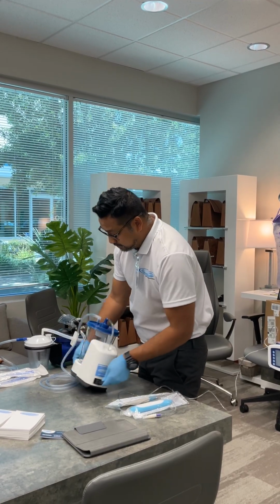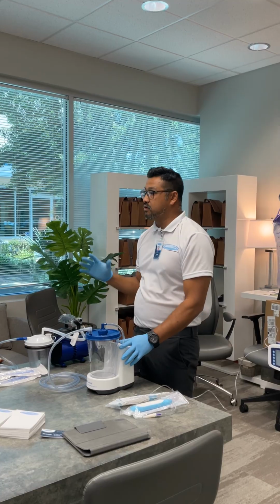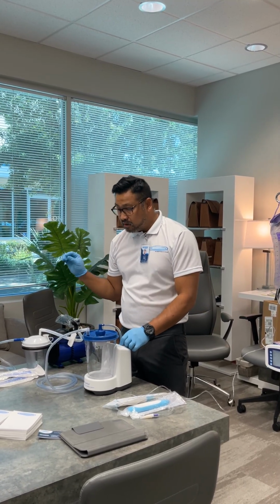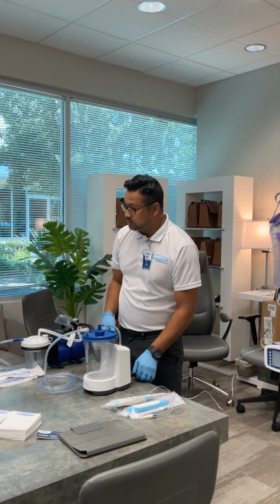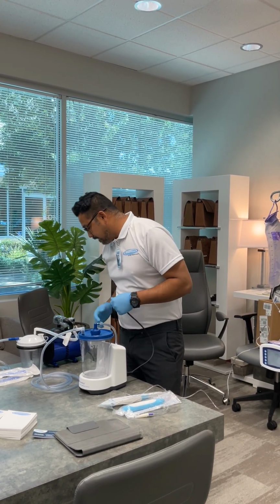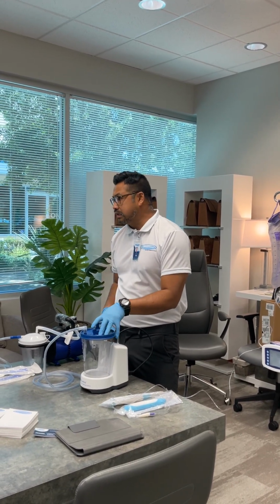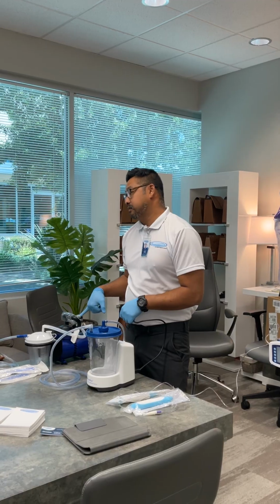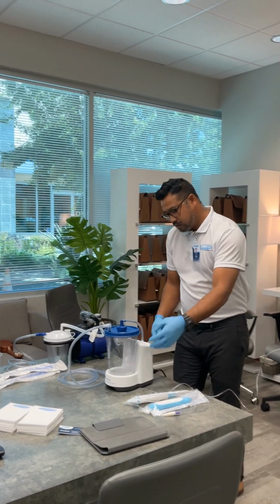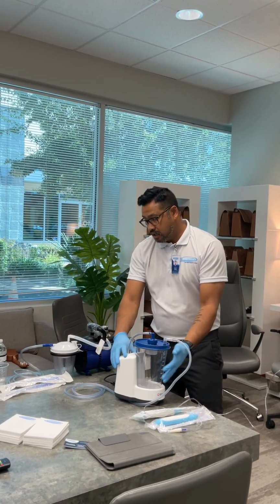Ideally, you do want to put this lower than the patient because it's a very slow, low vacuum, so it sucks a little bit and it drains downwards. It does suck, but not as hard as an oral one. I believe it's about 90 millimeters of mercury of suction, and the oral one starts at 100, so it's very faint suction. I'll go ahead and turn it on, and it just hums like that.